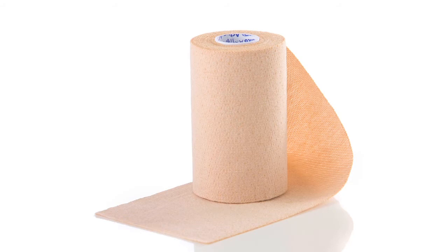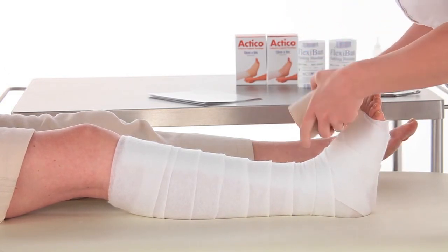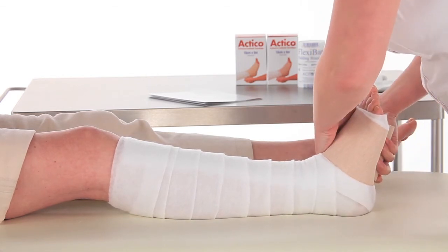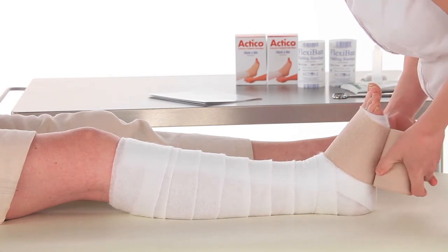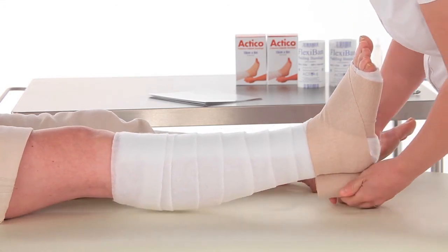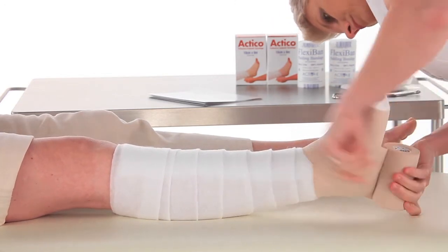Before applying Actico 10 centimetre, check that the foot is correctly positioned toes to nose to maximise ankle movement. Hold Actico with tension and apply two turns from the base of the toes. Roll Actico across the dorsum of the foot keeping tension. An extra turn may be applied in the middle of a long foot. Enclose the ankle and heel with a figure of eight.